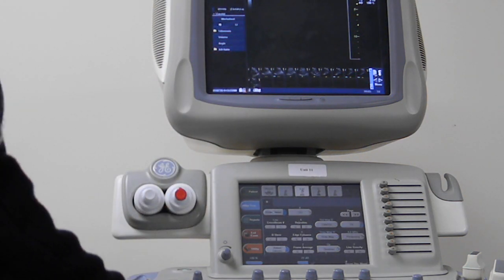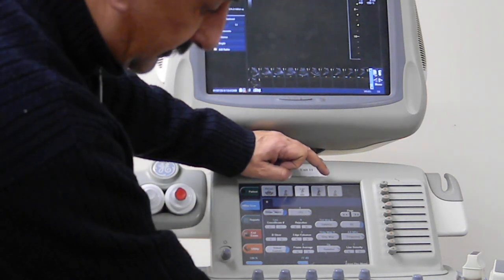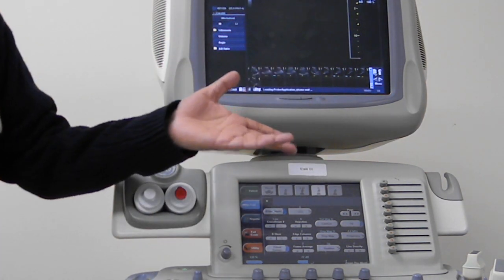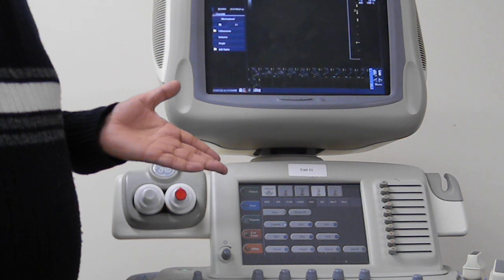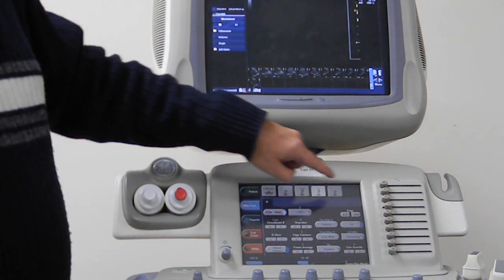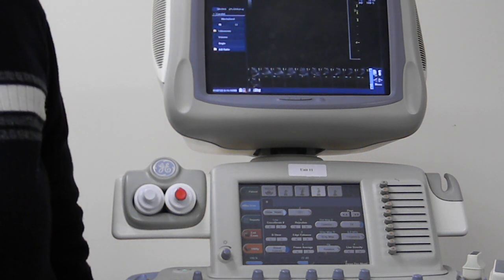and that's because they are just the two central slots where the transducers have been attached. Have you attached a transducer over that slot over there? You will have a function here that you could activate. So literally that's how you choose your transducers. Because you may have systems where there are 4 transducers attached. So you just choose the right transducer that you'll be using for that examination from your touchscreen. Did that make any sense?